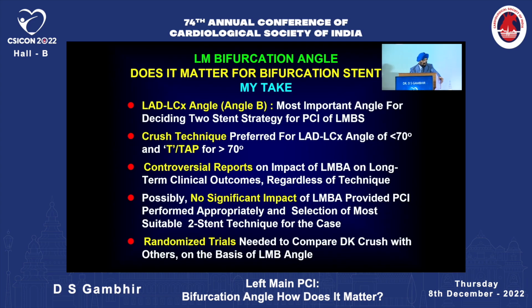So what is my take? Well, the LAD-LCX angle, a wide angle of more than 150 degrees, is the most important angle for deciding the two-stent strategy for PCI. Other angles may not be very important. Crush technique is preferred for an LAD-LCX angle of less than 70 and T or TAP for more than 70.